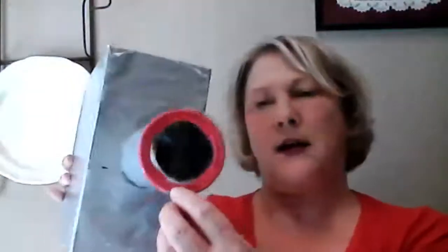That would actually come out clear. So there would be the image of the teeth, but at the bottom it would be clear. And that's known as cone cutting, because I didn't have my cone directly on top of my ring. It was off. So whatever's not covering down here would come out clear, and that's known as cone cutting.